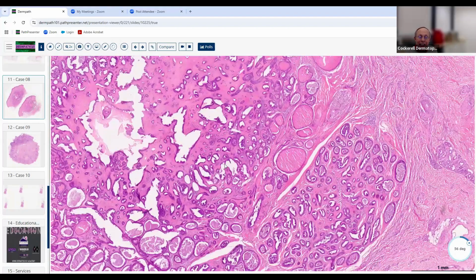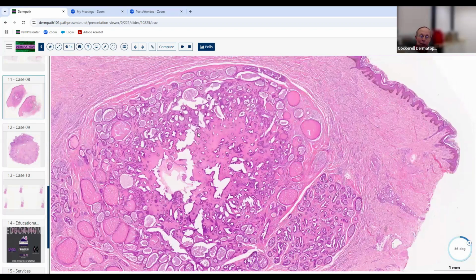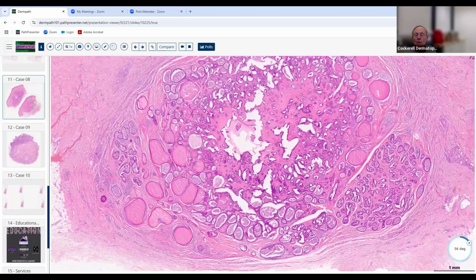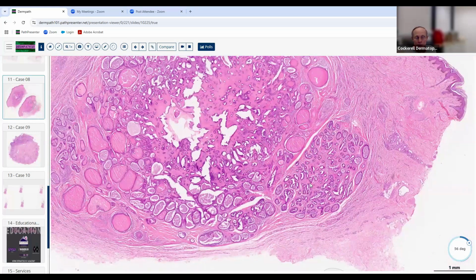It's an adenoma because it's a benign adnexal neoplasm that's glandular. Some of the lesions named by our ancestors who first looked at these have good names. Some maybe missed the mark a little, but this one is beautiful and it actually fits.